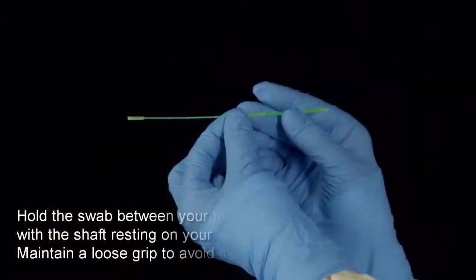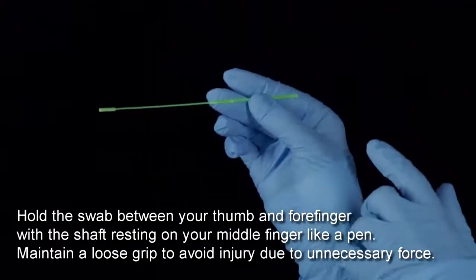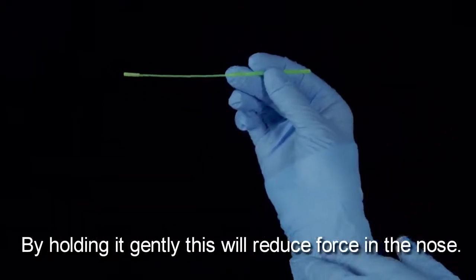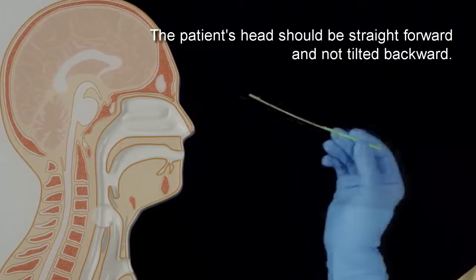Hold the swab between your thumb and your forefinger with the shaft resting on your middle finger like a pen. Maintain a loose grip to avoid injury due to unnecessary force. By holding it gently, this will reduce force in the nose. The patient's head should be straight forward and not tilted back.